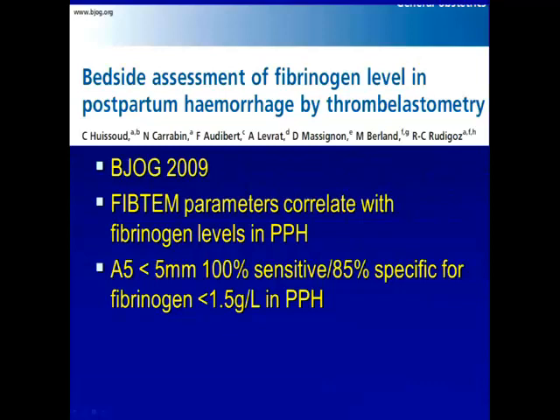Obviously, when we're in hearts, we have perfusionists and we can run ROTEMs. What do you do in the middle of the night with the postpartum hemorrhage here? You rush things down to the OR, to the lab. You would have perfusion on site for a postpartum hemorrhage, or coming on site within half an hour, by the time you've already done your first test and hopefully got a result. I mean, if we're lucky and there's an ECMO, we can, but otherwise I don't know what you would do. So yeah, for cardiac right now, it's the perfusionists that are running the test.